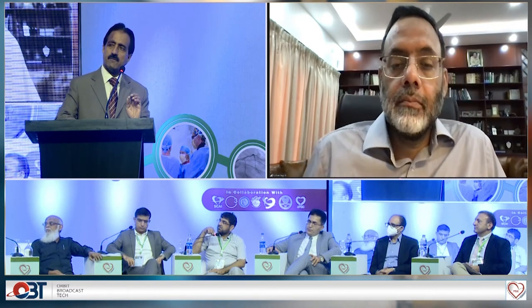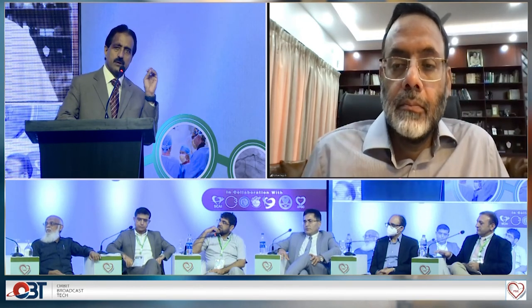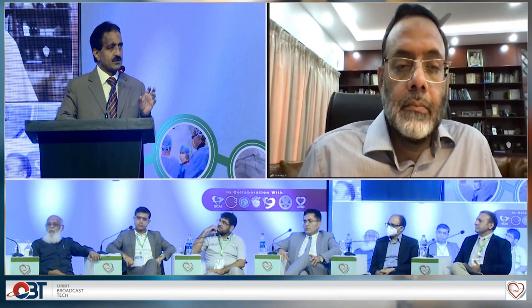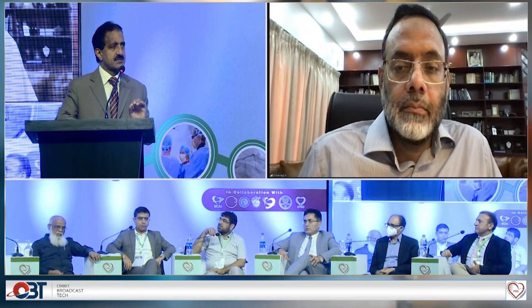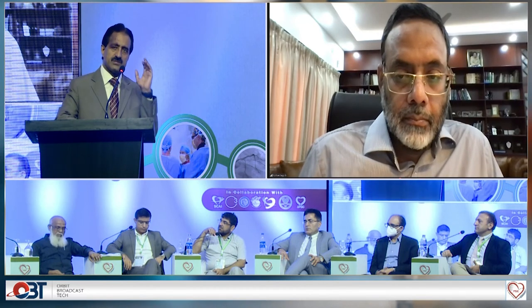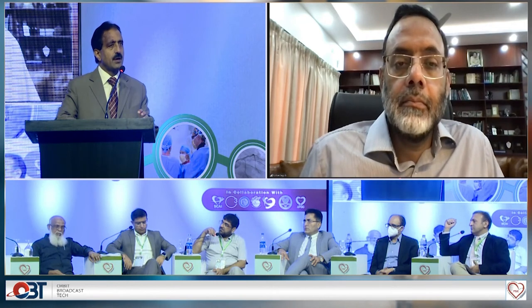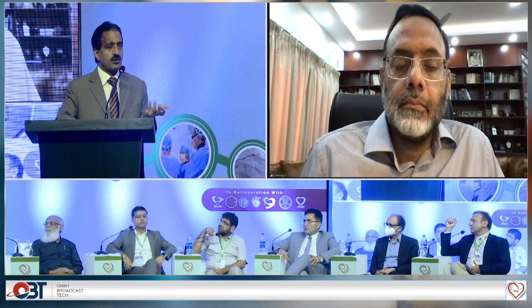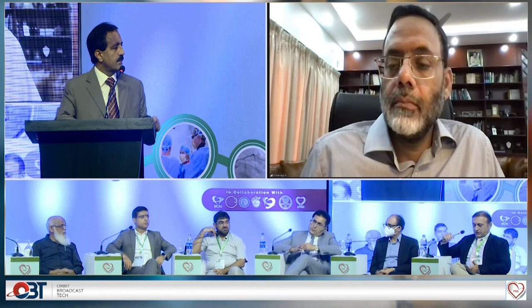I keep reminding my fellows all the time that they are focusing on the stenting, the balloon and the guide, but they often forget where the distal end of the wire is. This could be a very painful complication, distal wire perforation, because sealing that could be a major problem, and you have to stay there for hours. I think all of us have probably seen that and gone through it. But the best way is to prevent the complication and take all the precautions. Jabbar, you had a point before.